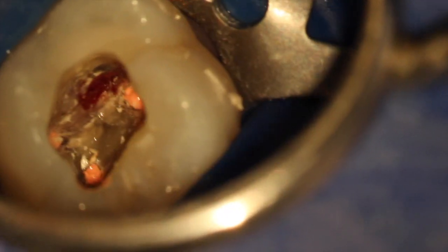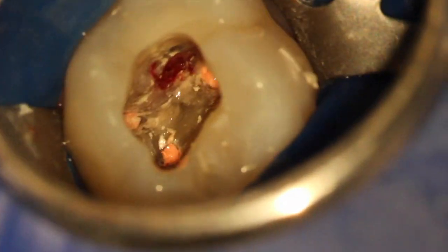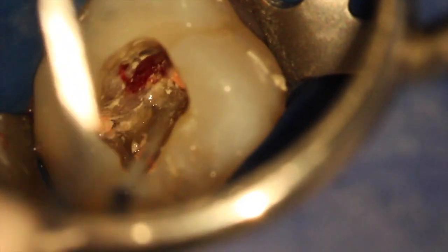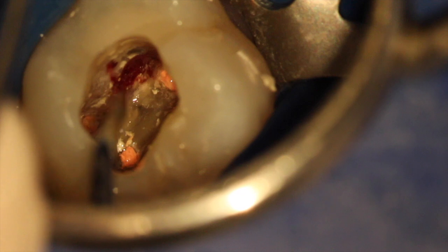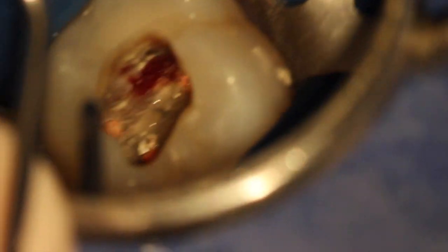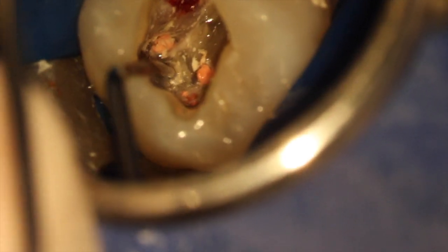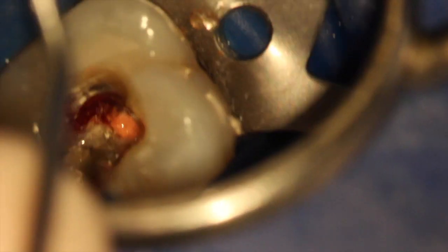You can see here under the microscope the treatment was done. There's perforation, there's some bleeding, there's some ingrowth of gum tissue. As we probe around the distal of the large defect, I noticed some movement, some mobility of the dentin, and started picking away at it.